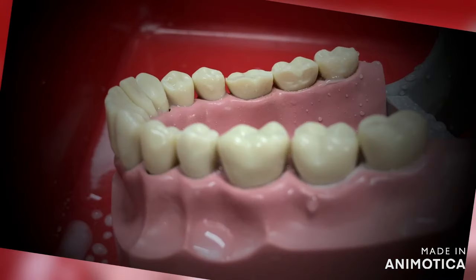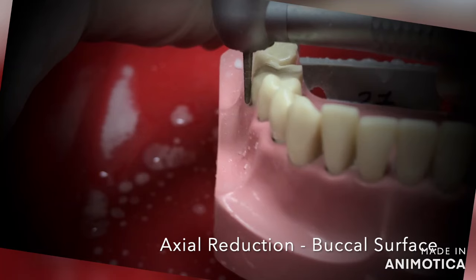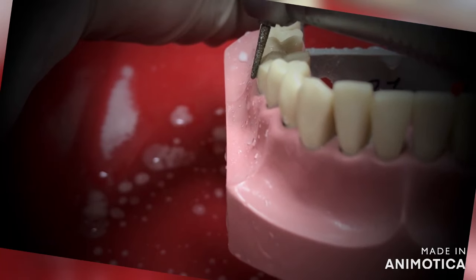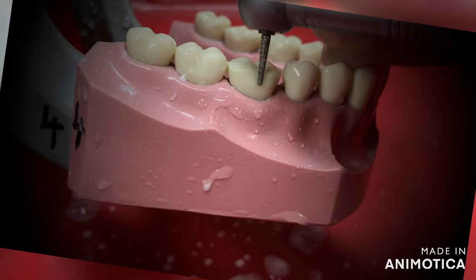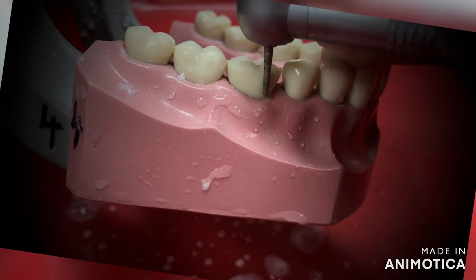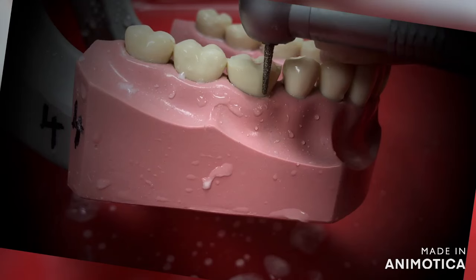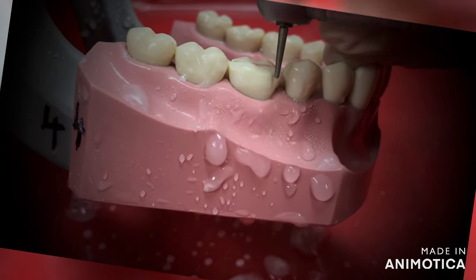Next we move on to the buccal surface. As you can see, the buccal surface has two planes — one is the cervical plane and the other is the middle third or occlusal plane. So you can do your preparation by following these two planes. Here also I am using the same TR-13 tapered round burr. I start by creating the grooves on the buccal surface, keeping the burr parallel to the cervical part of the tooth. Three grooves are created on the buccal surface as shown in the video.